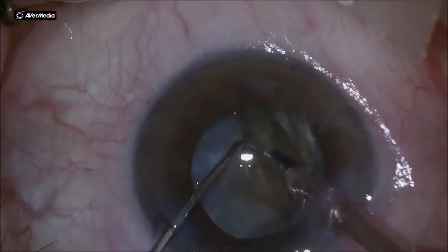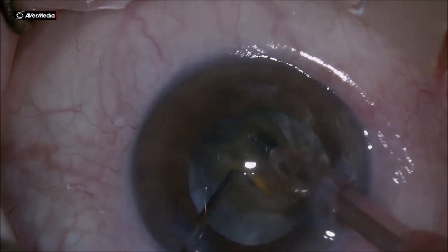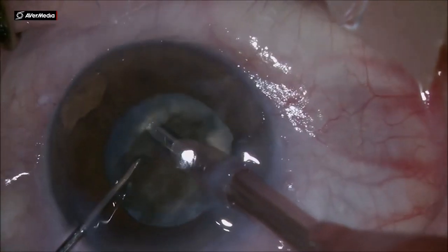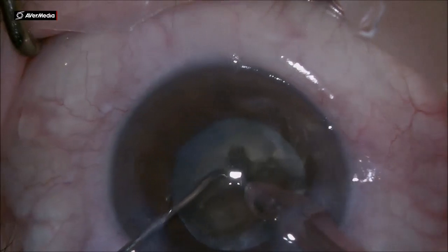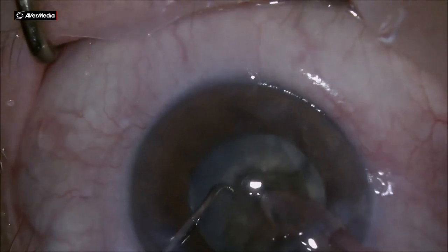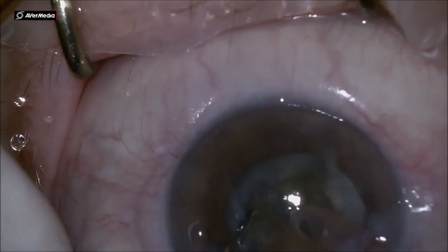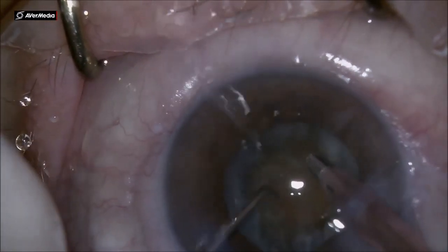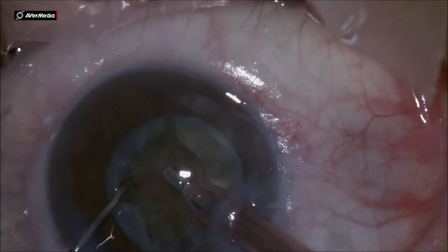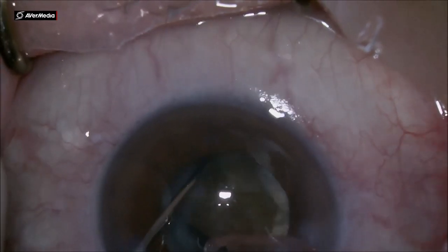The posterior plate of the cataract is very stubborn and won't crack under repeated separations from the chopper and the phaco probe. But we can proceed to phaco emulsification using these two instruments to fashion a divide-and-conquer approach if we don't succeed with the stop-and-chop technique. We have to keep separating into smaller and smaller fragments until we can take it out little by little.